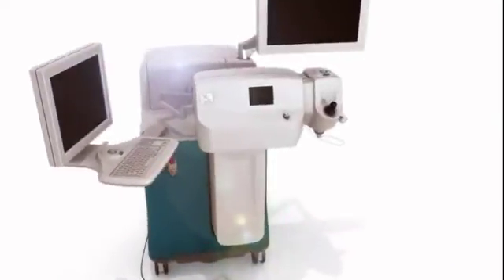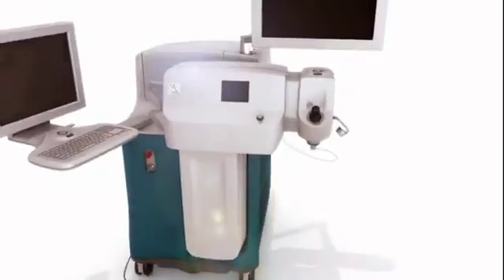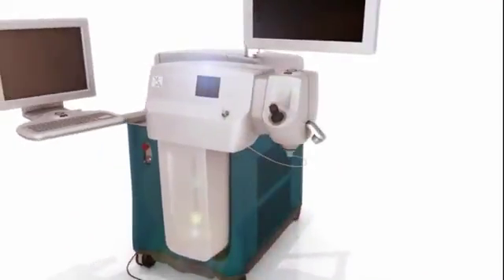The first leap forward in laser refractive cataract surgery, Alcon's LensX laser is putting the future in motion. Delivering the accuracy of a femtosecond laser to refractive cataract surgery, the LensX laser is designed to predictably perform many of the most challenging aspects of traditional cataract surgery with highly reproducible computer precision.